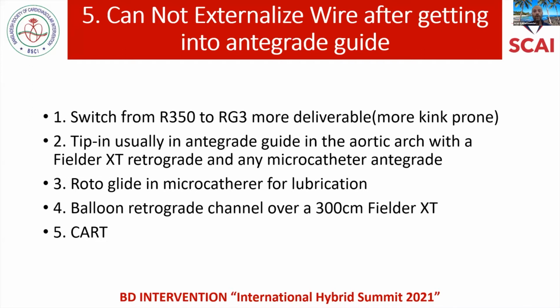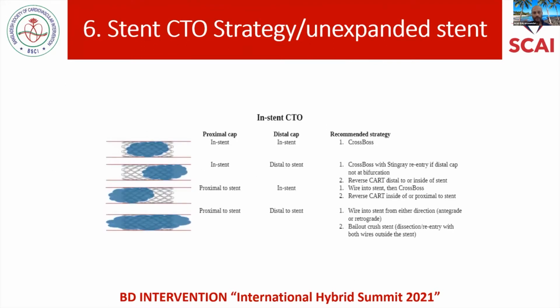Again, basics always start with, especially in a septal when you have a wire across but the microcatheter won't, increased guide support, use a guide extension, whatever. You might want to consider dilating the septal if you do know for sure that the track where you're dilating is septal.